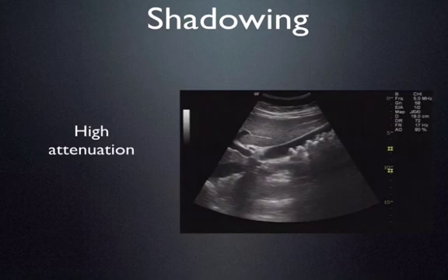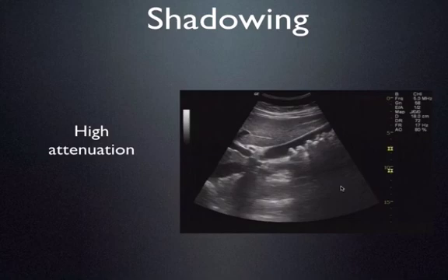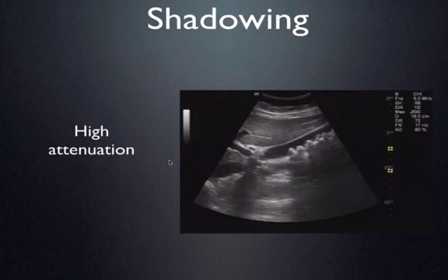The first artifact I want to talk about is shadowing, and that's usually a result of high attenuation — specifically clean shadowing. What we have here is a gallbladder, and you see numerous stones. Behind those stones you'll see lots of what we call clean shadowing — it's almost completely dropped out to black. You'll see shadowing anytime you're ultrasounding gallstones, kidney stones, bone, or some foreign bodies.